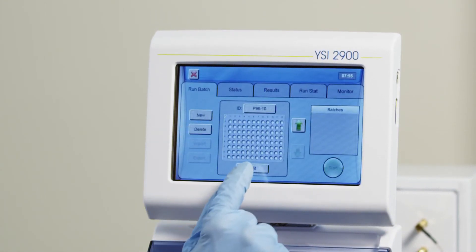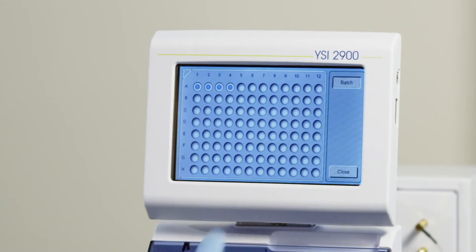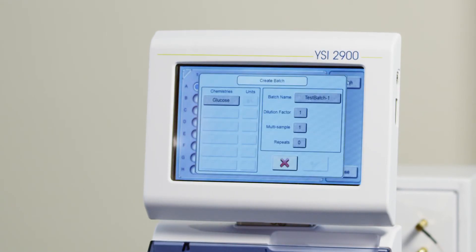Select Edit, and select the tube locations for each sample in the batch. When you are finished, press Batch, and select the chemistries that you'd like to run for each sample.